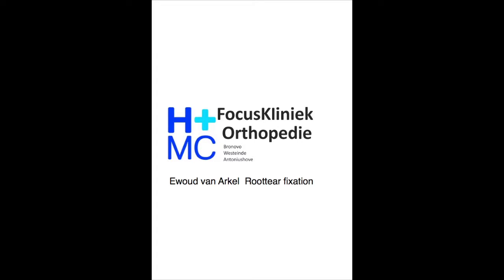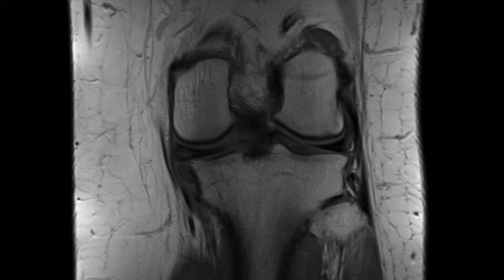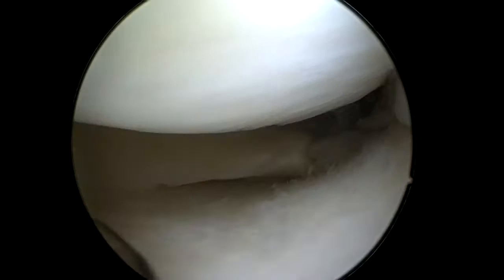In this video I will show you how I fix a root tear of the meniscus. This is the MRI, and here you can see the root tear posteriorly. The other aspect is extrusion of the meniscus over the tibia plateau.